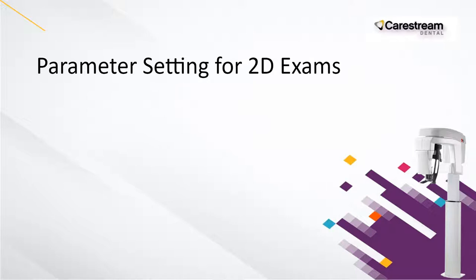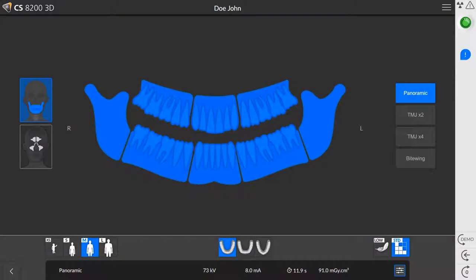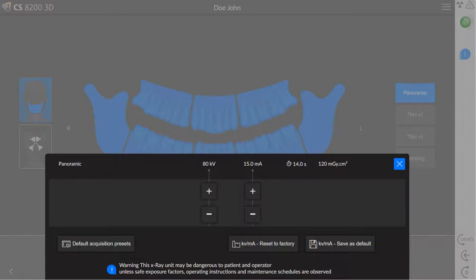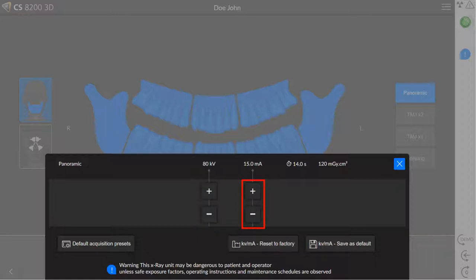For parameter settings for 2D exams, for patients whose bone density requires KV and MA settings that are different from the defaults, select the menu button to display the parameters window and select the settings you want. Select here to fine tune the KV setting. KV sets the penetration power of X-ray photons through the body. A higher bone density requires a higher KV, but results in a lower contrast in the image. Select here to fine tune the MA settings. MA sets the number of X-ray photons released from the X-ray tube. Increasing the MA does not provide more penetrating power or lower the X-ray contrast; however, it will provide an image that is darker overall.